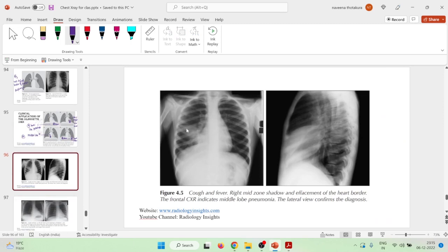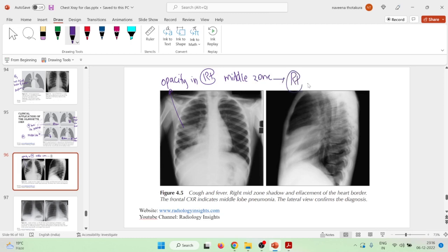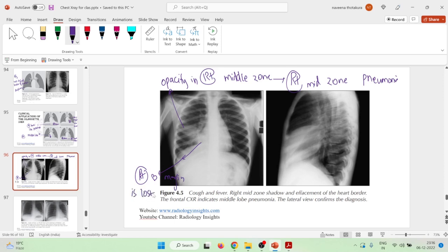In this X-ray there is an opacity in the right middle zone — this is right mid-zone pneumonia. One important thing here is that the right heart margin is lost. In another image, there are irregularities in the cardiac shadowing where the intensity of the cardiac shadow varies. This is also a picture of middle lobe pathology — middle lobe pneumonia.